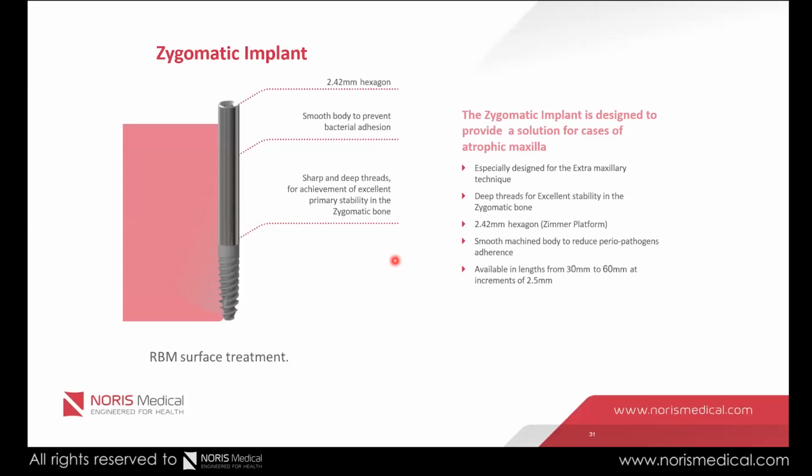The implant itself is quite different from what the previous implant looked like.